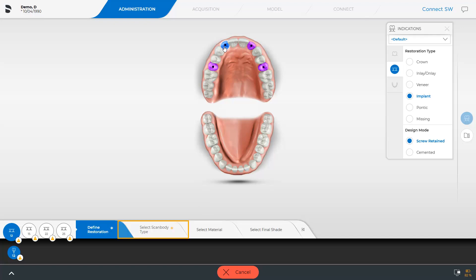The next step in the step menu, Select Scan Body Type, is marked with an asterisk since this is a mandatory step. You can now determine the pontics or, as in our case, switch to the next step.